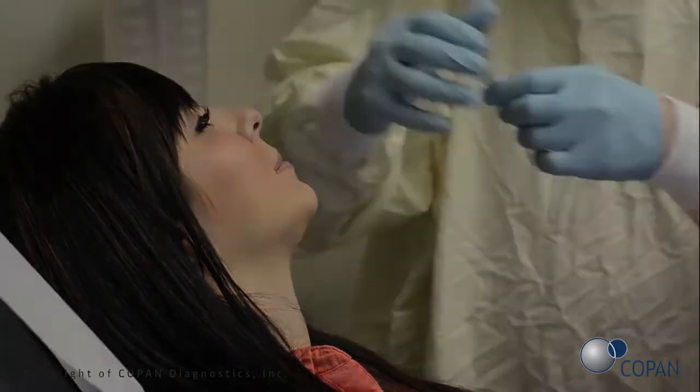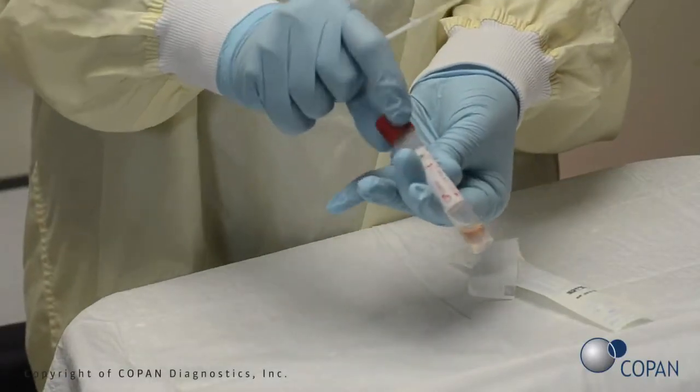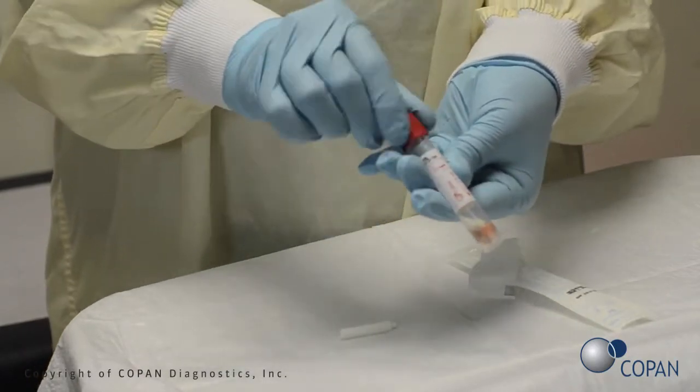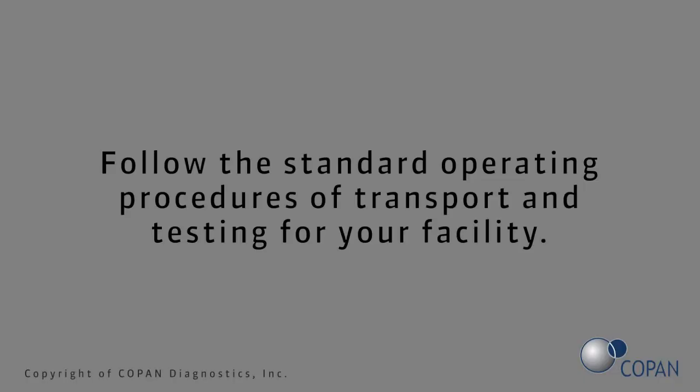Gently remove the swab and perform the test according to the manufacturer's instructions. If the specimen testing is not performed at the point of care, refer to the manufacturer's instructions for transport and storage recommendations. Follow the standard operating procedures of transport and testing for your facility.